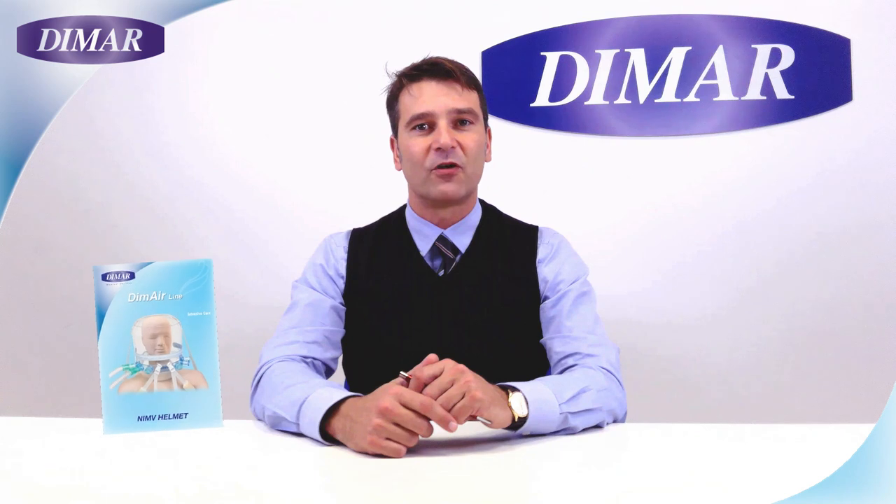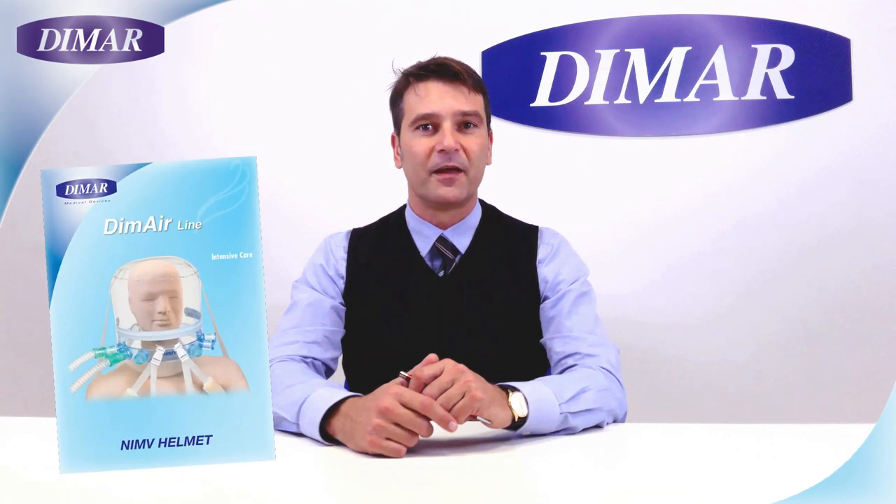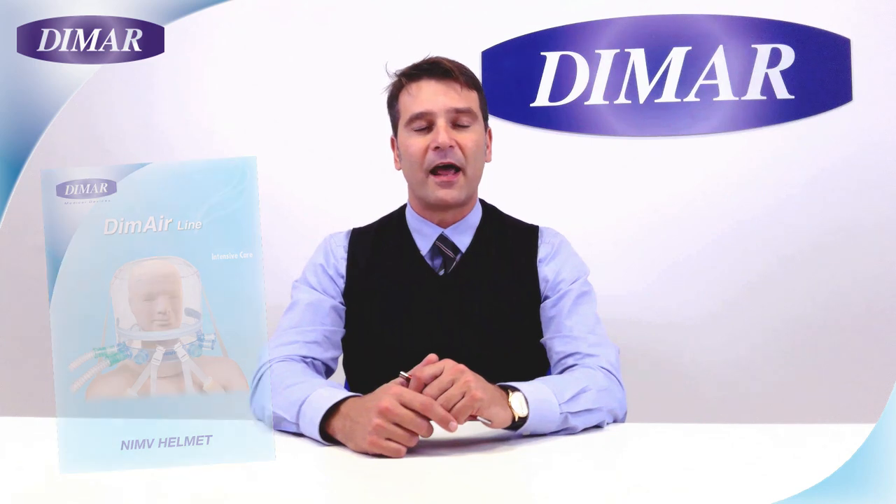Hi everybody, my name is Riccardo Lambertini and I work for DIMAR. Today we will go through the steps to correctly wear an NIV helmet.